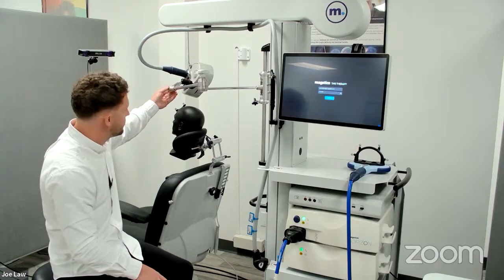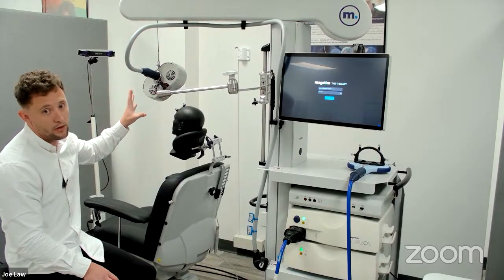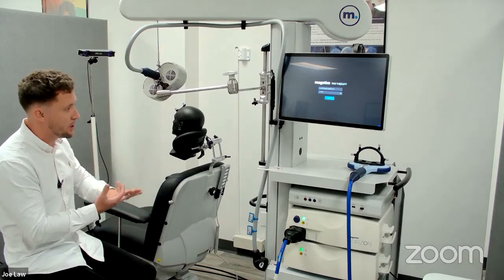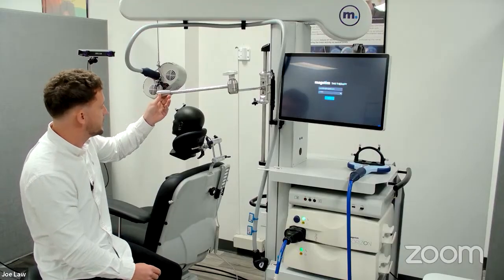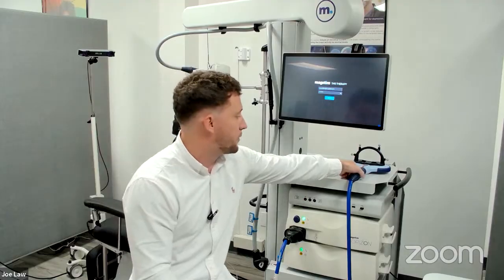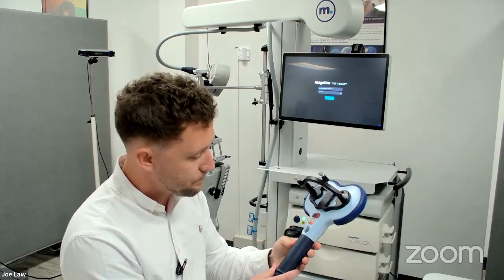This here is our treatment coil. Something important about the treatment coil with Magstim: you only need one treatment coil. So regardless of what indication you are doing, whether that's MDD, OCD, etc., you only need the one treatment coil. There is no need to purchase additional coils. Whilst I'm on that topic, we do also provide you with a mapping coil, purely for the mapping process.